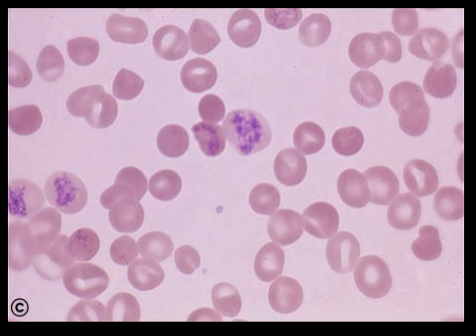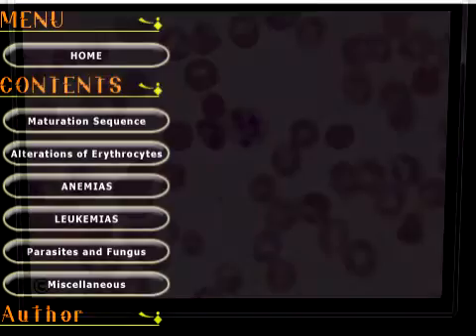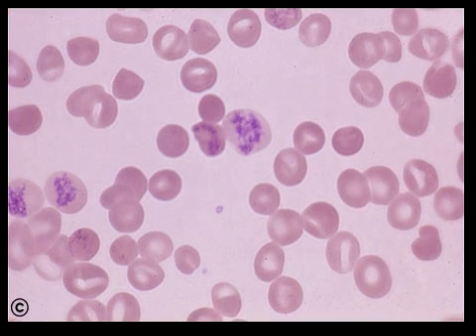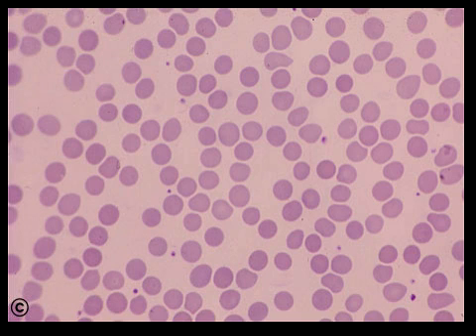So these are reticulocytes, and here's another slide of reticulocytes as well. In our class, we didn't really go too much into this, but we did touch upon it a little bit. And then lastly, we have erythrocytes, and this is how they look. If you notice, some of the cells are white in the center.